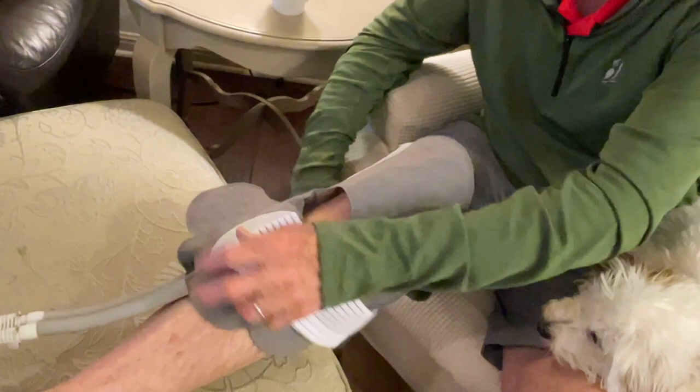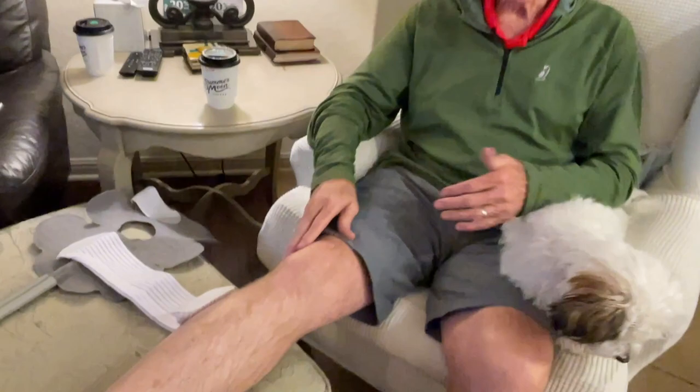Every night — through the day — I would put this on and it would help. See the scar, it's been almost two years now. Good to go.